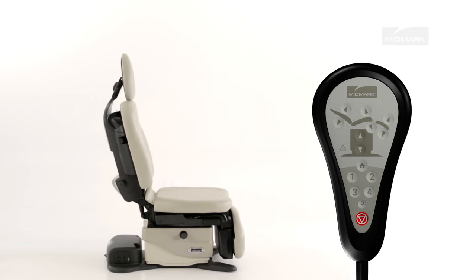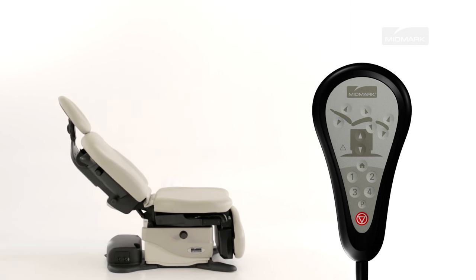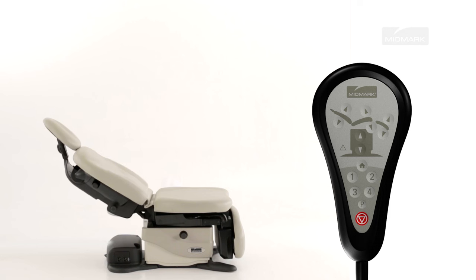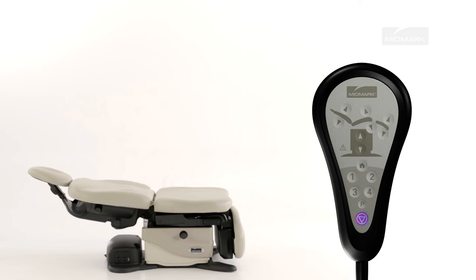To move the back section up or down, press and hold the appropriate button on the table hand or foot control. Movement stops when the up or down button is released, the maximum or minimum position is reached, or the stop button is pressed.